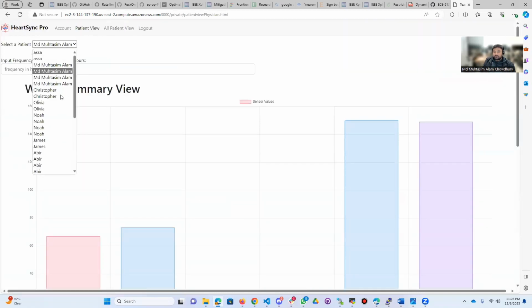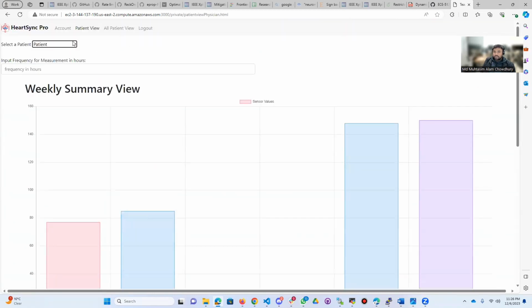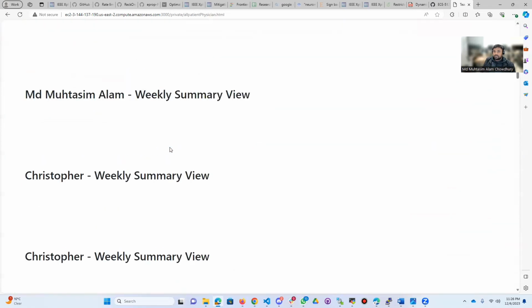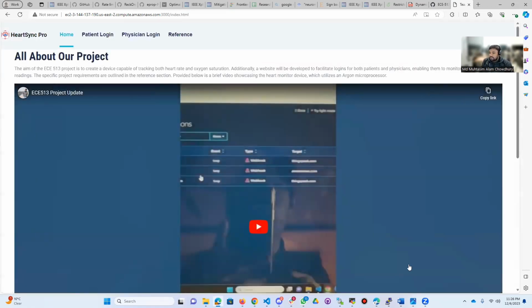person, and also we can choose another person. I have other persons filled in like this. We took the data, and the all patient view has all the patients here, and then we can log out.